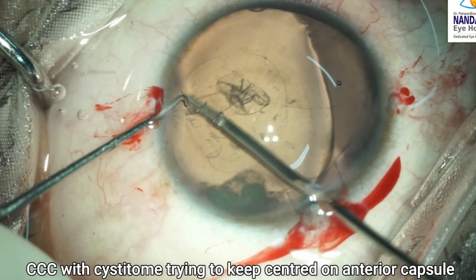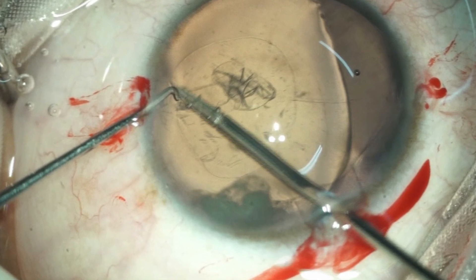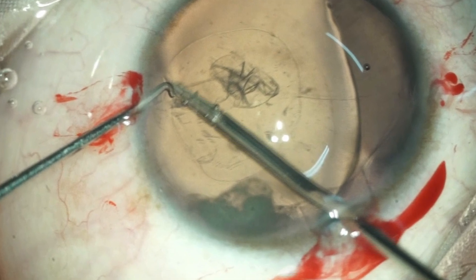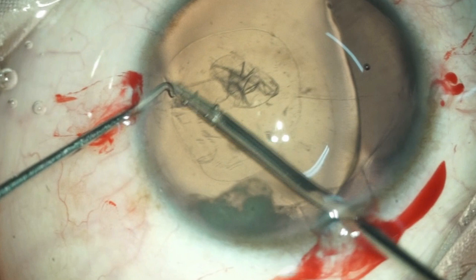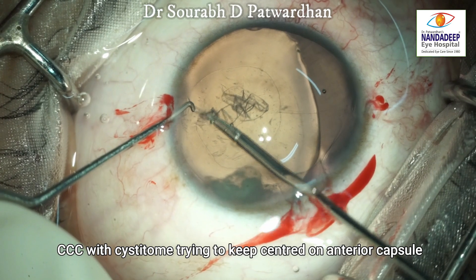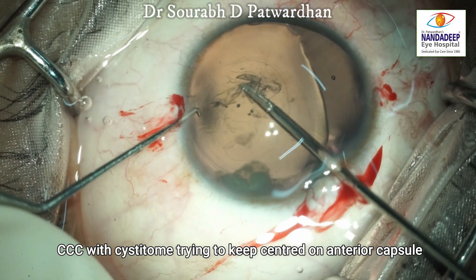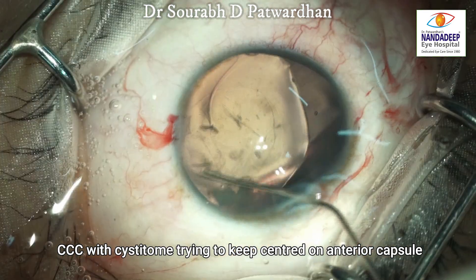Another important thing is that the CCC should be appropriately away from the area of zonular dehiscence, because if you don't have this much space it is difficult to put the capsular hooks to support the lens in that area. So stay away from the area of dehiscence.